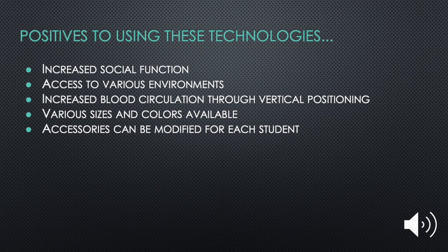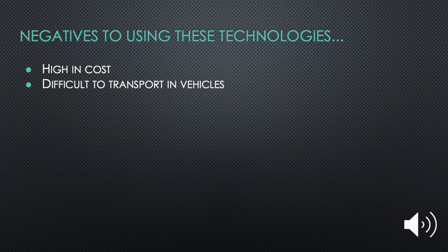The positives to using these technologies, there's increased social function. They're able to socialize with peers in ways that they may not have been able to in a typical wheelchair or whatever. They have access to various environments. There's increased blood circulation through vertical positioning. These standers come in various sizes and colors, so students can choose what type of color they want, and depending on the student's size, that's very beneficial that they come in different sizes. Accessories can also be modified for each student, as I said before.